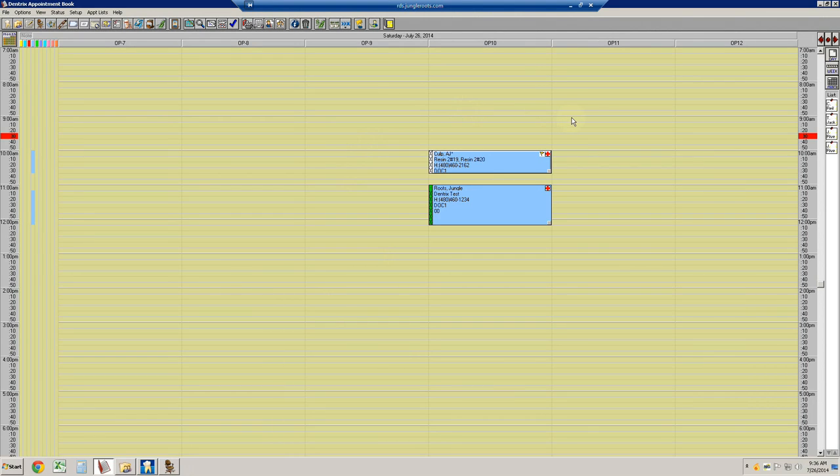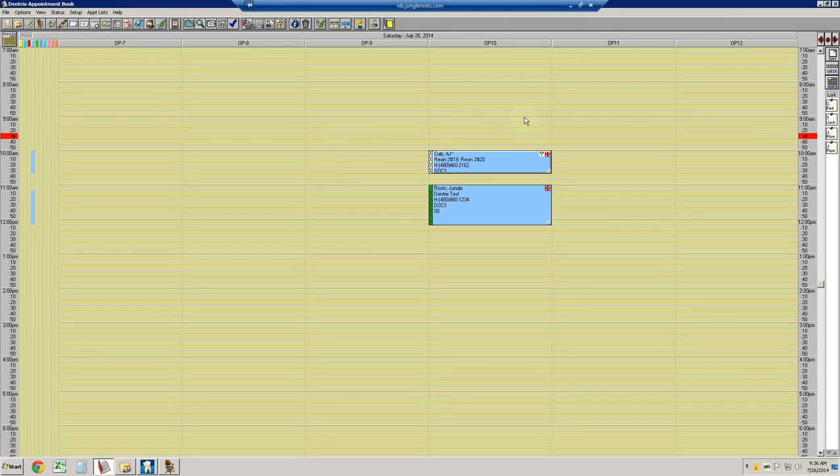The next area that we're going to be covering are X-rays. In this particular section, we're going to assume that X-rays have already been taken, and we're going to do a number of things with them.